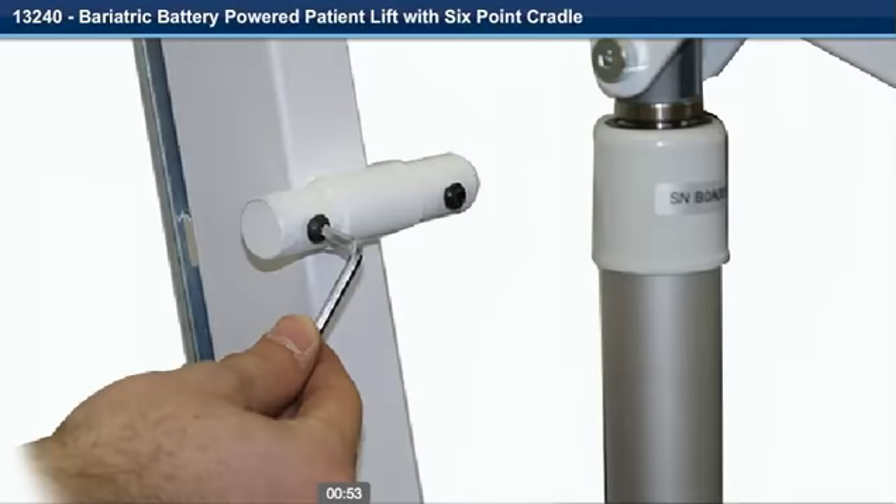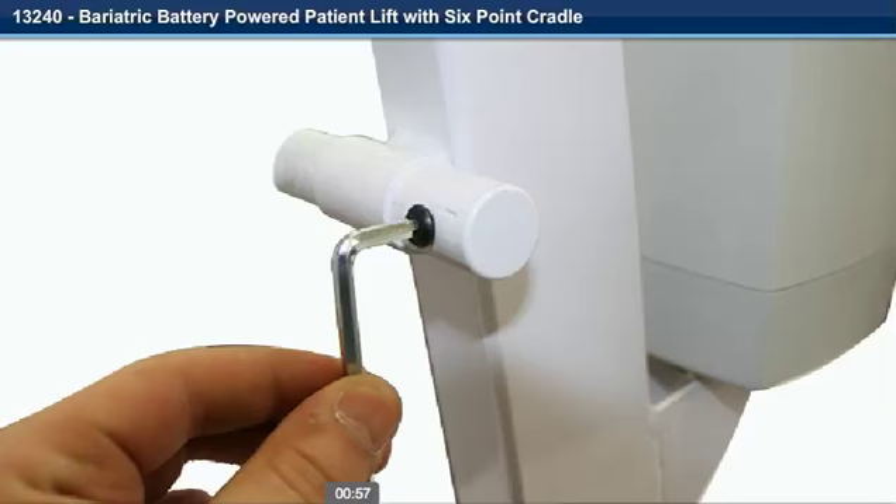Step 6. Remove the Allen cap screw from the upper and lower push handle posts with the Allen wrench provided.